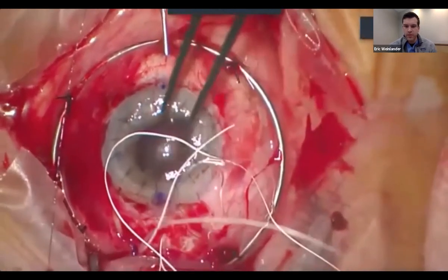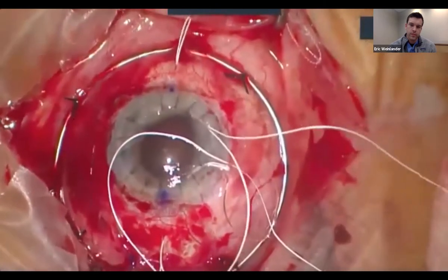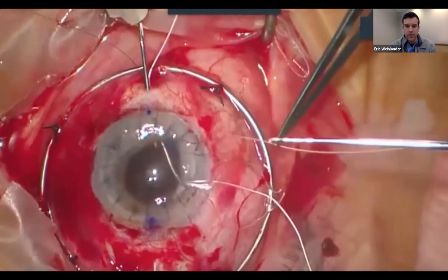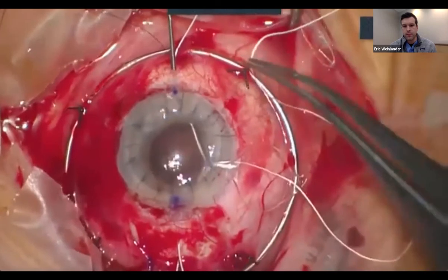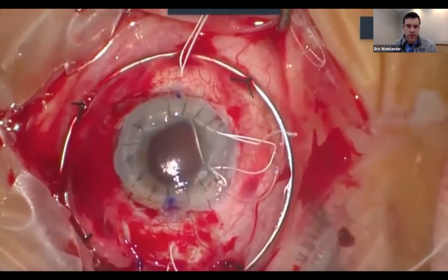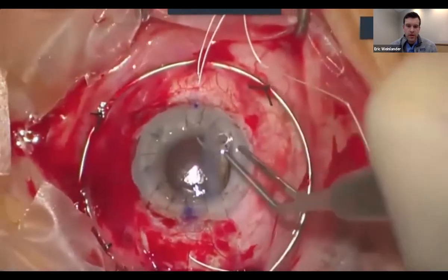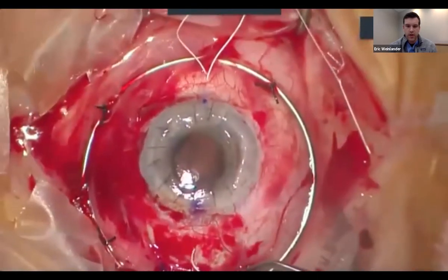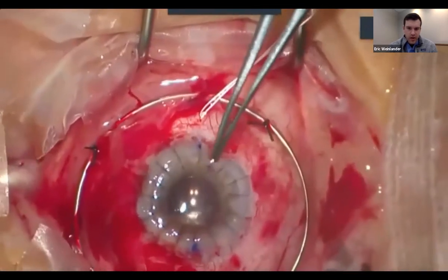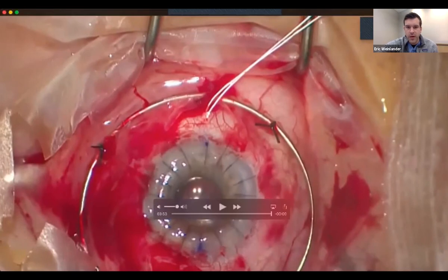We repeat this maneuver for the remaining three fixation points, making sure we're on the appropriate side of the fixation sutures internally and externalizing the appropriate suture through each sclerotomy, including inferior fixation points. We leave the fixation suture a little long, but that's not a problem — you can externalize the tail through the sclerotomy. We insert the lens through the large PK wound, center it, temporarily tie it, and perform the penetrating keratoplasty. At the end, we finalize the knots under minimal tension, internalize and trim the knots through the sclerotomy, then cover with peritomy.